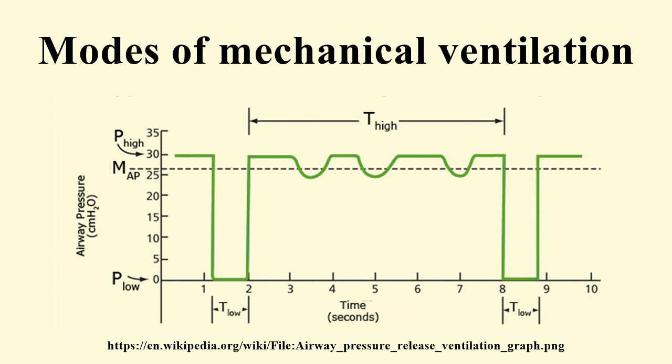Although similar in modality, these terms describe how a mode is intended to inflate the lung, rather than defining the characteristics of synchronization or the way spontaneous breathing efforts are supported. Intermittent mandatory ventilation has not always had the synchronized feature, so the division of modes were understood to be SIMV versus IMV. Since the American Association for Respiratory Care established a nomenclature of mechanical ventilation, the synchronized part of the title has been dropped and now there is only IMV.